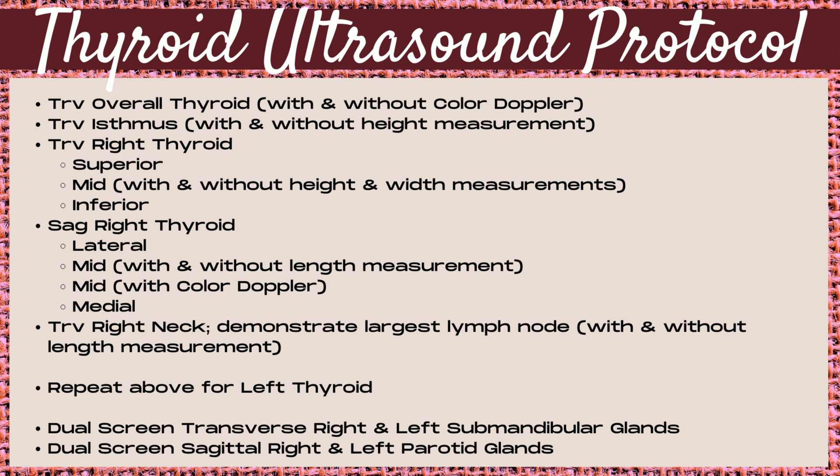Next, moving on to the transverse right neck, you want to take images demonstrating the largest lymph node with and without a measurement. You can do an AP measurement, a length measurement, or measure the lymph node in three dimensions — this will depend on the protocol of your site.